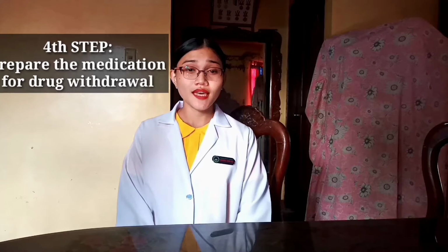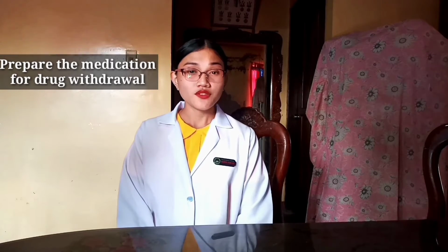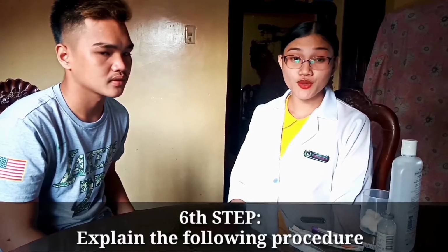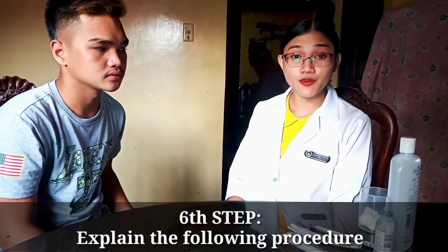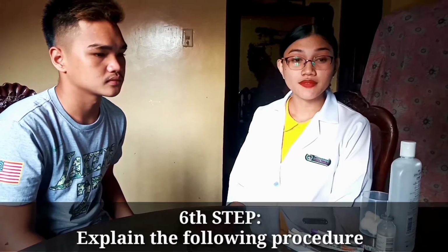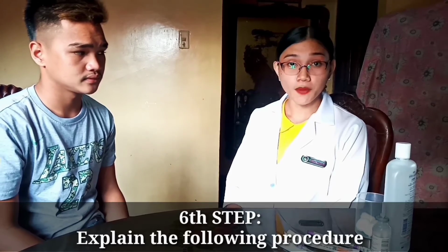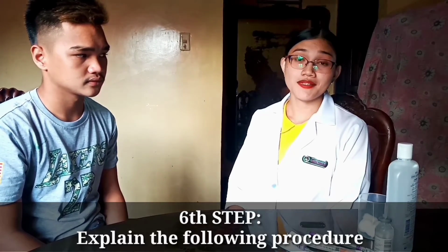So the fourth step, prepare the medication for drug withdrawal. Check for the expiration date and the manufacturer date. And for the fifth step, prepare the client and provide for the client's privacy. The sixth step, explain the procedure, that the medication will produce a small wheal or bleb. It usually looks like a wheal on the forearm. So, it looks like this.